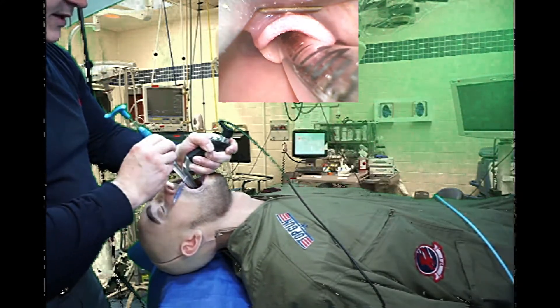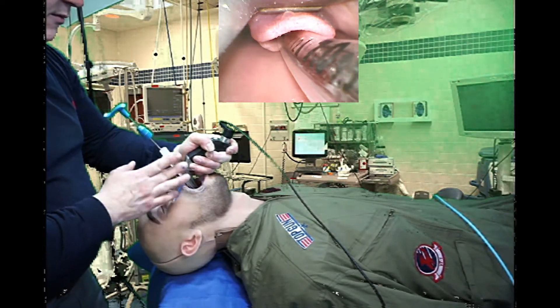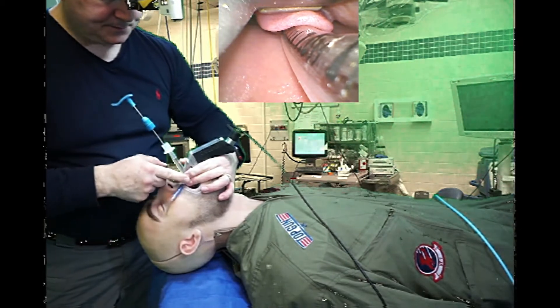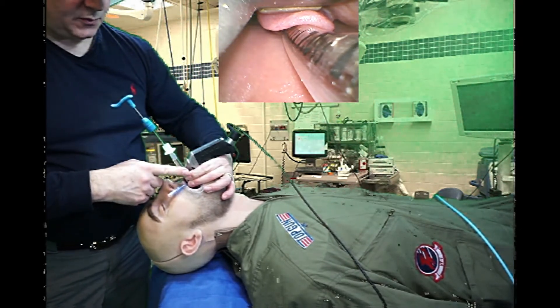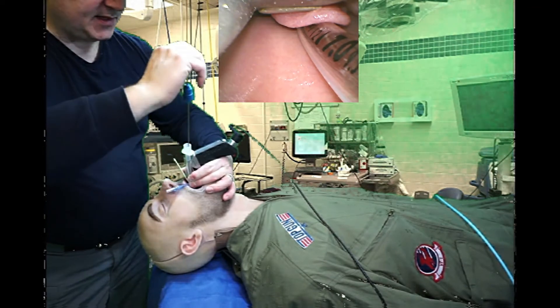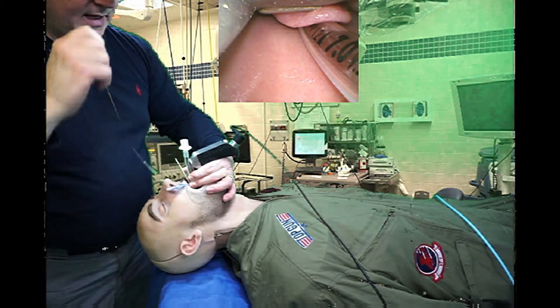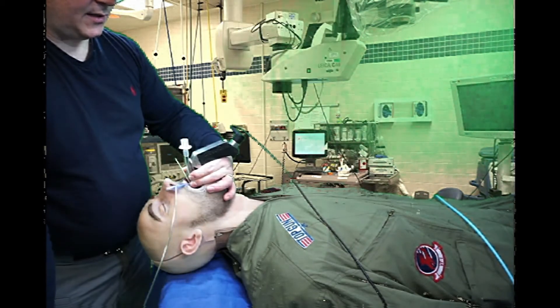The mannequin needs a little bit of lubricant. If I want to remove my own stylet at this point, I'm going to take a step to the side, hold the laryngoscope and the tracheal tube together, and grasp the stylet. This is a ridged stylet like a GlideScope stylet — you can't pull it straight out; it has to be brought out in an arc.